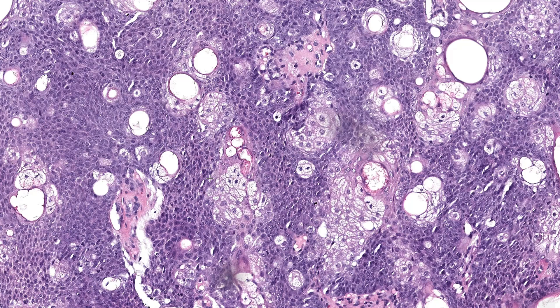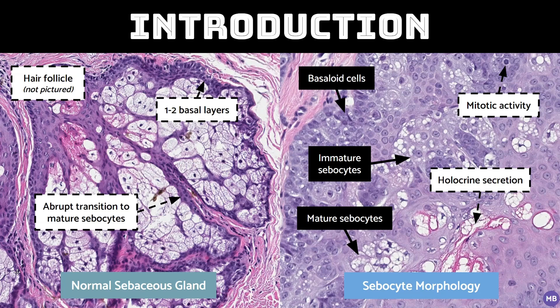Before we get into the differential, let's go back to the basics. A normal sebaceous gland is composed of small lobules of mature sebocytes — these large vacuolated cells — with a thin rim of peripheral basaloid cells, the cells that give rise to the sebocytes. Sebocytes secrete sebum, an oily substance, via holocrine secretion, which essentially means the cells die to release their contents. You can see a bit of that right here. Normal sebaceous glands are also associated with the hair follicle.